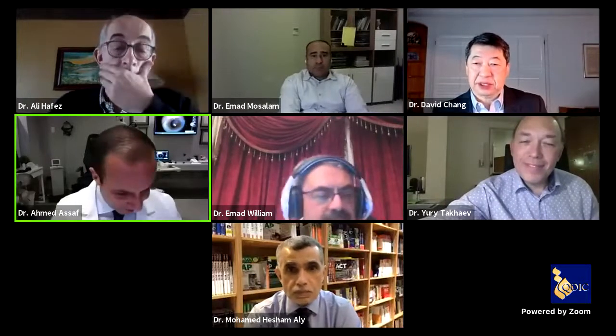Thank you very much, Dr. David. It's a nice presentation. I would like to ask you, would you implant a three-piece lens in the sulcus and do the optic capture? I learned this technique from you myself, to ensure better centration in the long term.